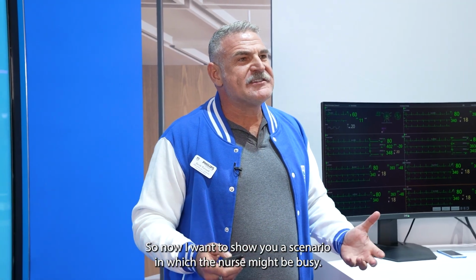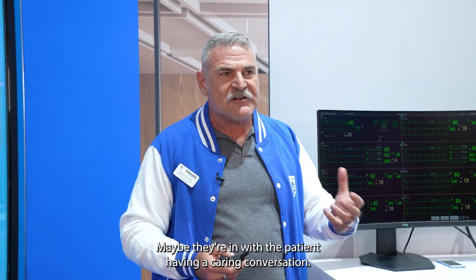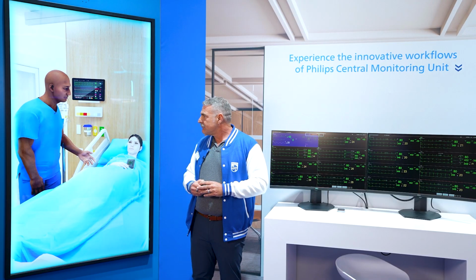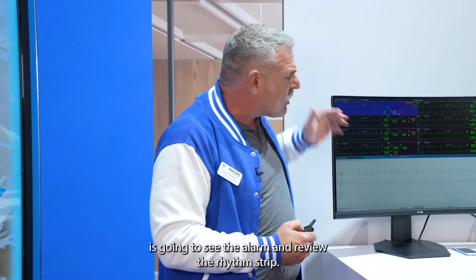So now I want to show you a scenario in which the nurse might be busy. Maybe they're in with the patient having a caring conversation, maybe they're in isolation. So an alarm is going to go off in the room. And the monitor tech is going to see the alarm and review the rhythm strip.